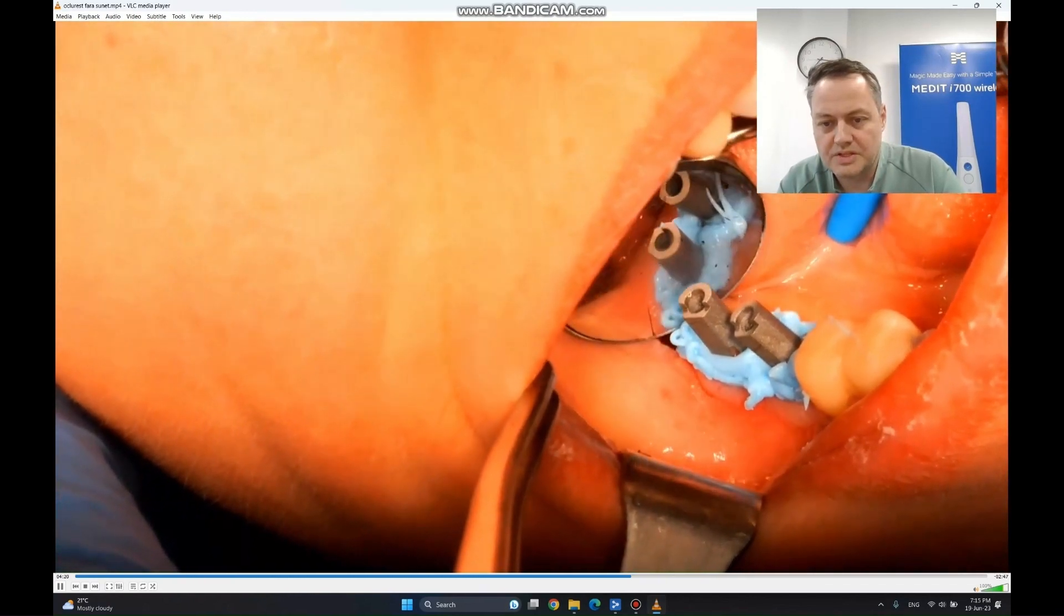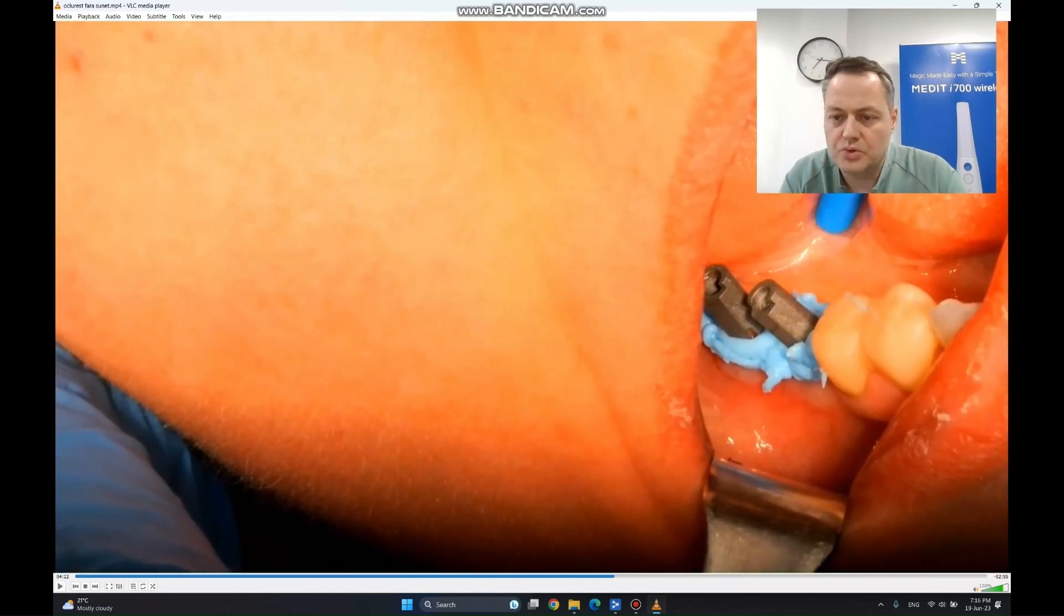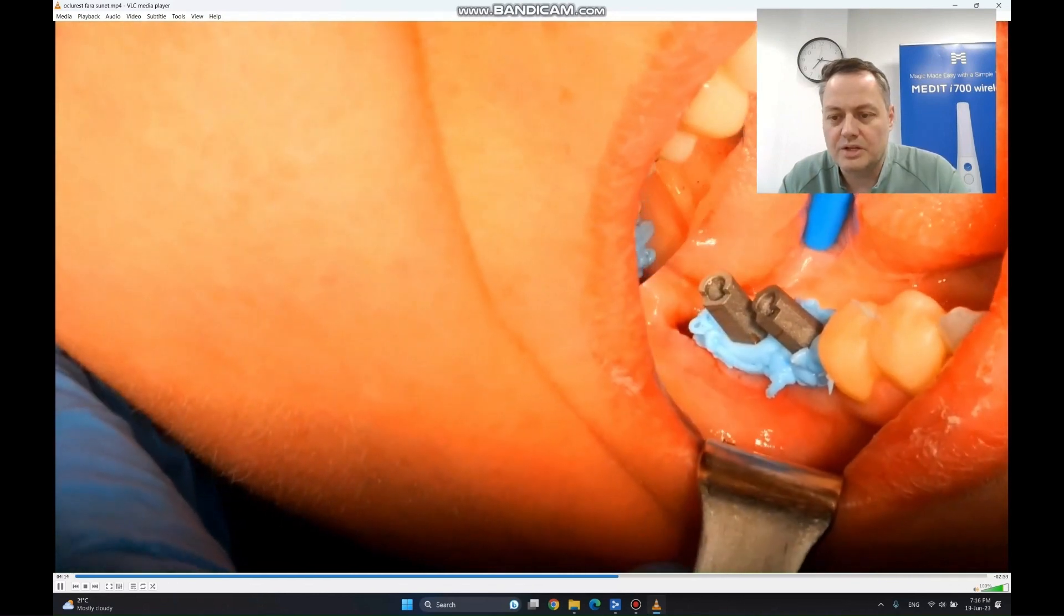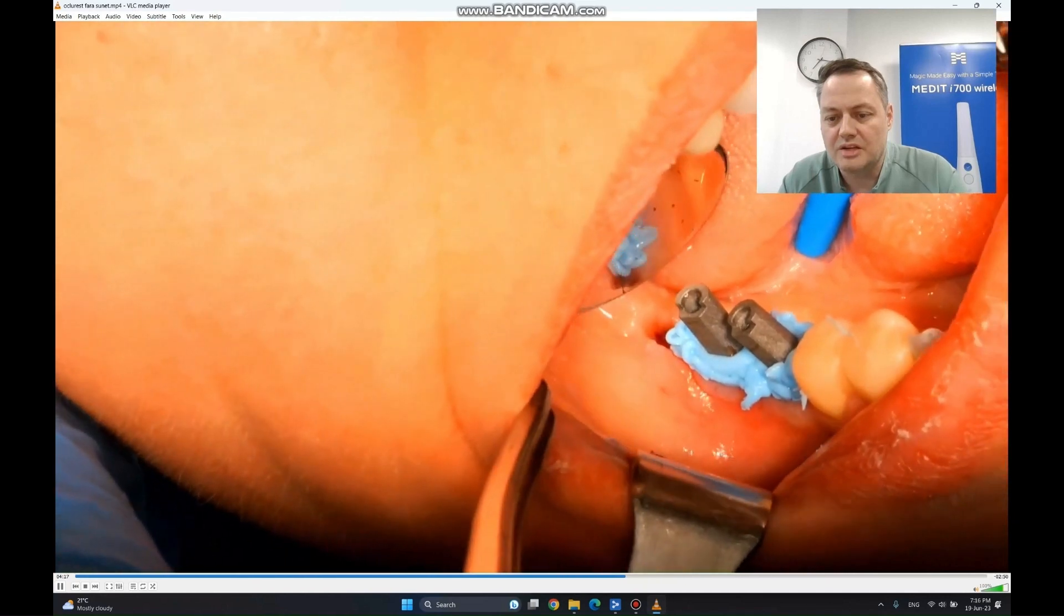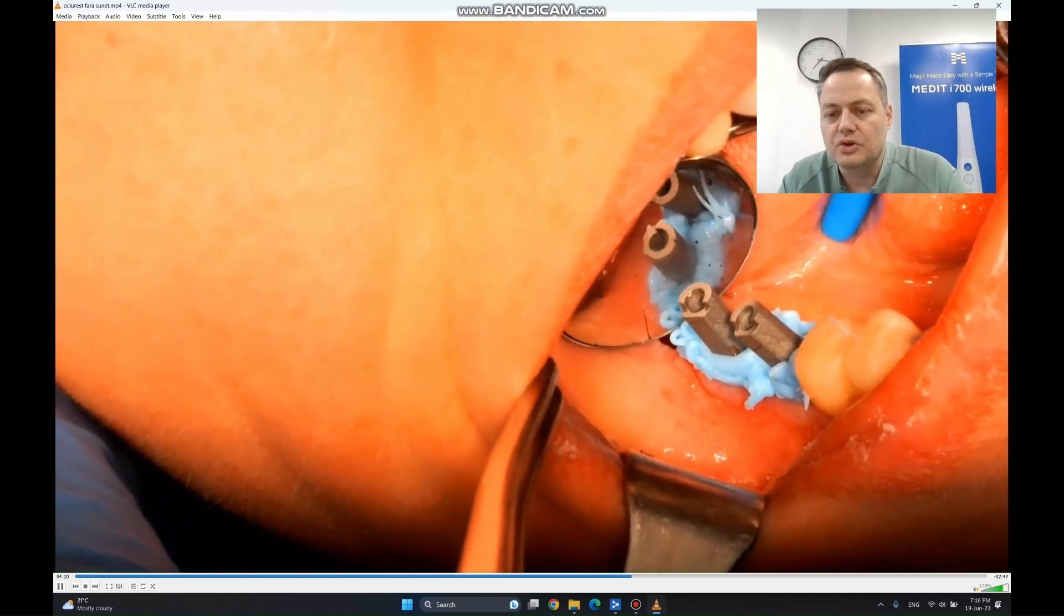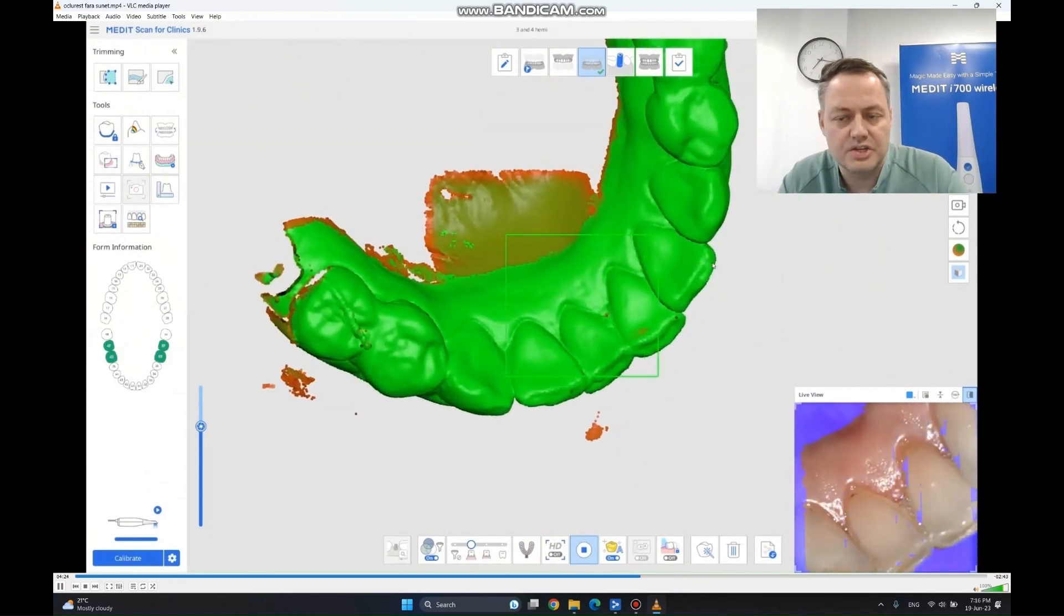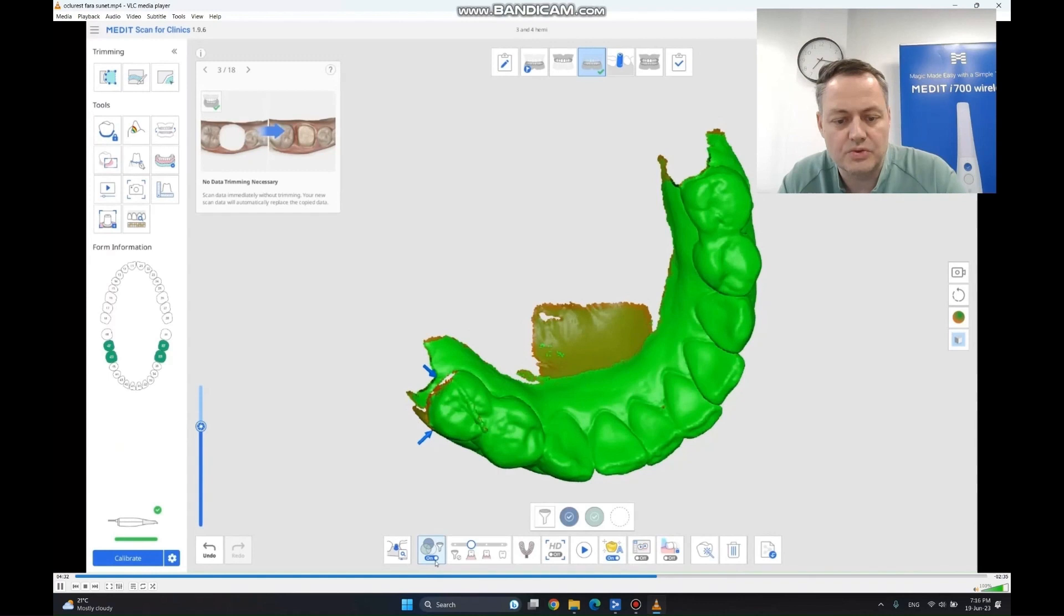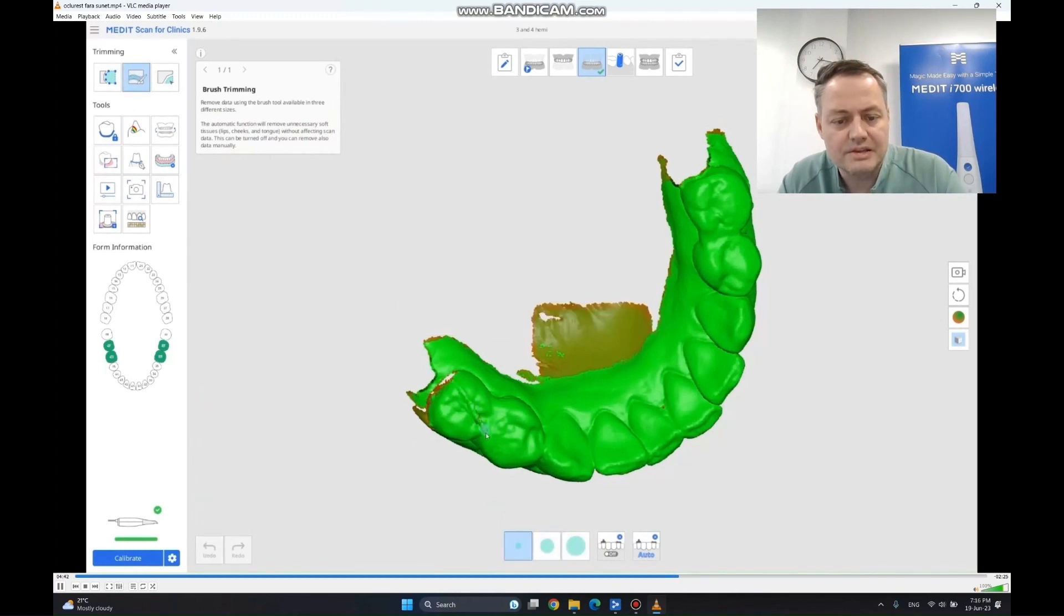You can see the detail everywhere. At this point, I want to go back and point out that on the premolars on this side, you are going to see a little strand of material that is not allowed to stay there. If we are taking an impression, we have to take great care of not getting material on the surfaces of the adjacent teeth, as I did here. After I got the teeth, I'm going to stop the filtering so that I can get the blue of the material, and also delete this little strand of material and remove it from those two premolars.